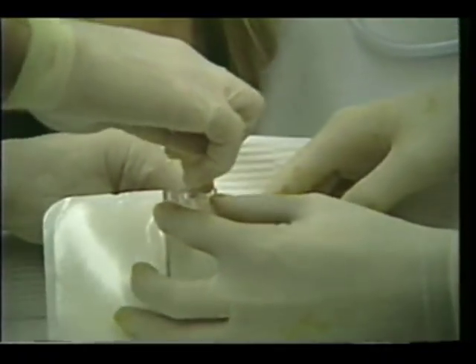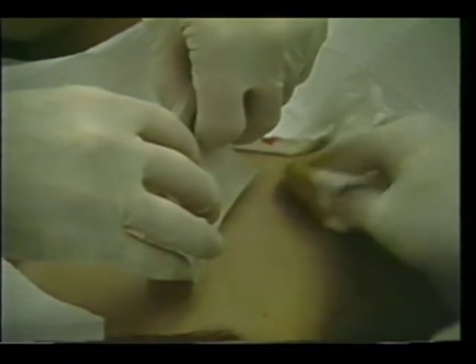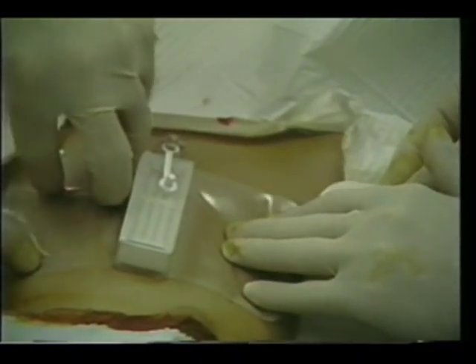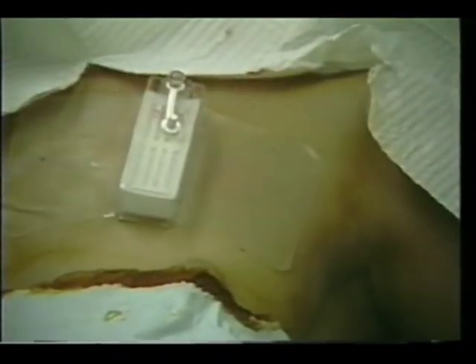The trocar is removed and the full length of the catheter is introduced into the pleural cavity. The silicone sponge material at the base of the catheter helps to provide a seal at the incision site. The covers on the side flaps of the adhesive patch are peeled away and the device is secured to the chest wall.